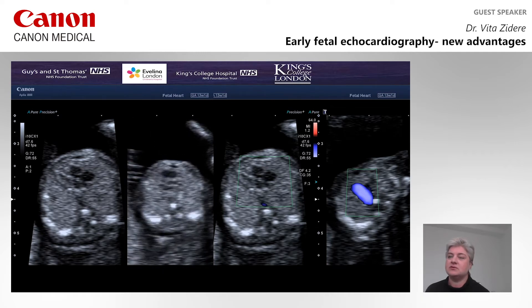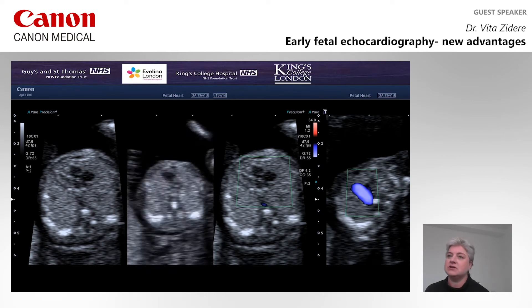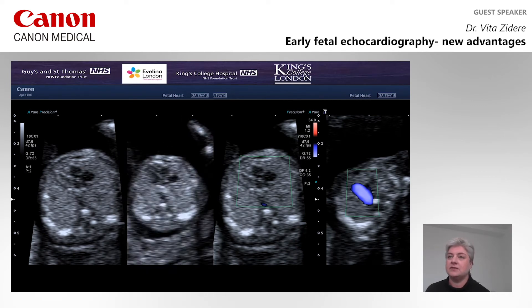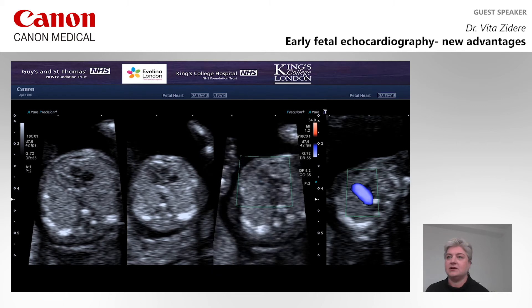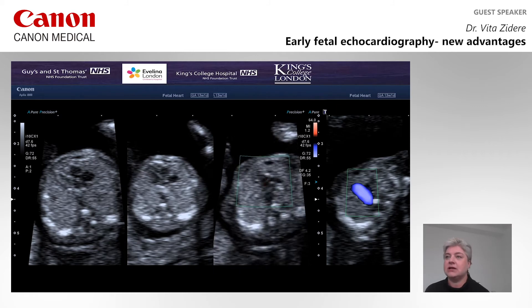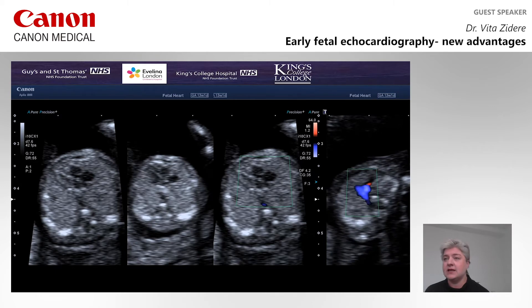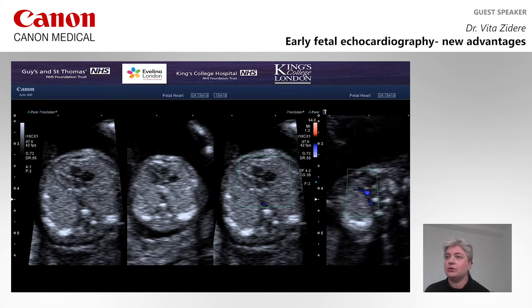Colored Doppler at the four-chamber view demonstrates flow across the AV valves. There is trivial tricuspid valve regurgitation and filling of both ventricles. There is antegrade flow across the enlarged pulmonary artery. We can see flow in the pulmonary artery and transverse aortic arch. There is antegrade flow in both pulmonary artery, duct, and ascending aorta. The flow within the superior vena cava is in red.